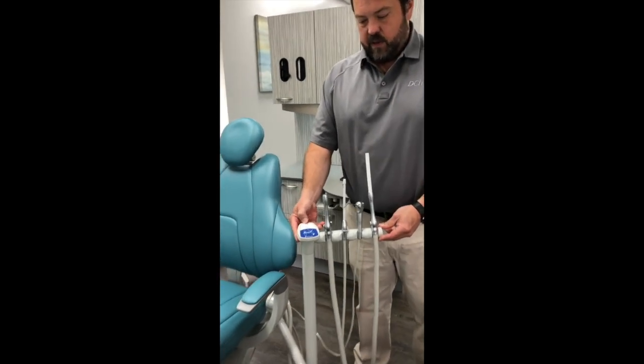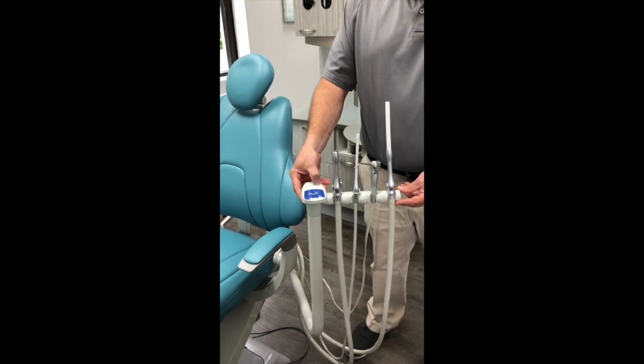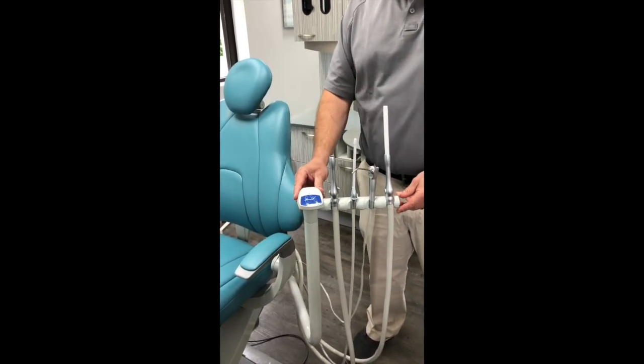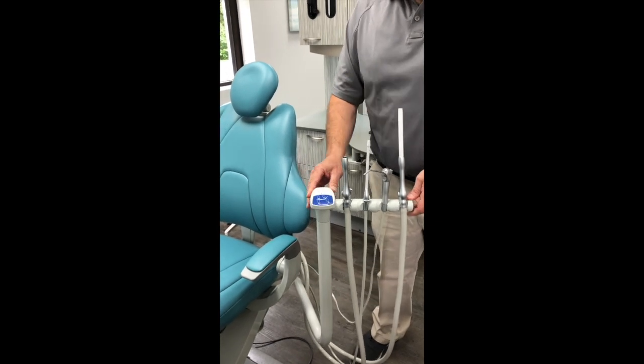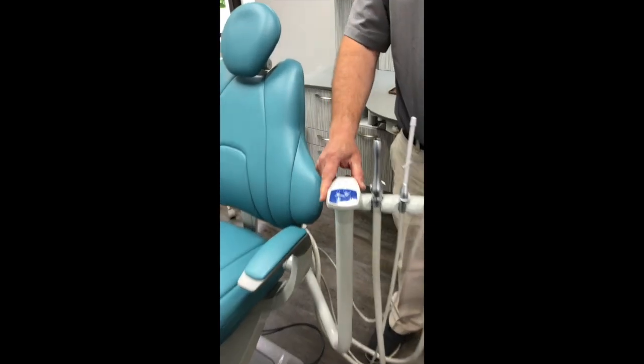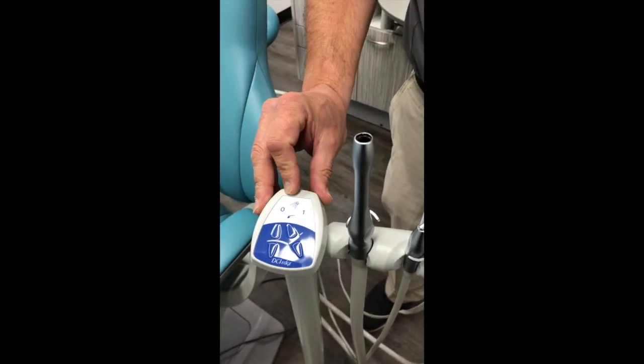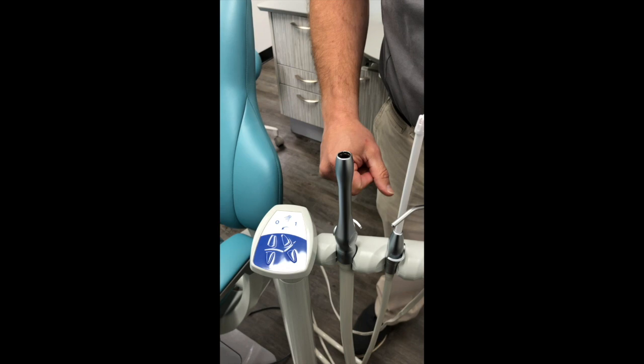You have a touchpad where you can turn the light on and off. You have your chair preset positions, your return position, and then all of the other chair controls. If you've watched the dental unit video, you know how to program all of these. If not, please go see the dental video to understand the operation of the touchpad.